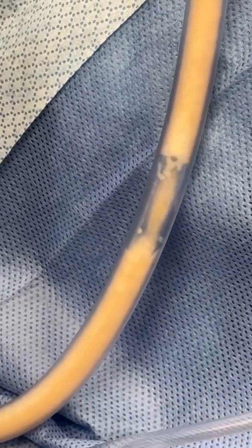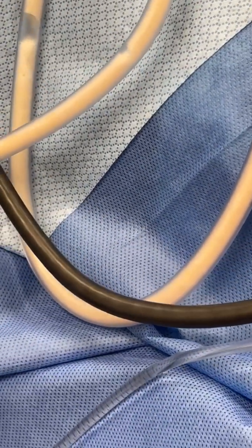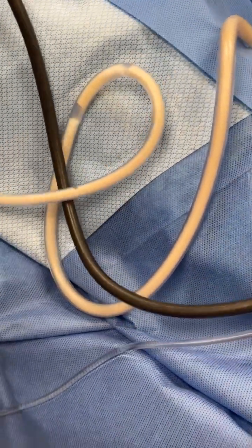So she's not gonna have a fat transfer to the buttocks. We already did an incredible fat transfer to her. Her buttocks are absolutely gorgeous. So we're now going to further define her abdominal wall muscles. That's what we're doing. But that output is almost white, isn't it? Yes. It's incredible. It's a pure, beautiful fat.